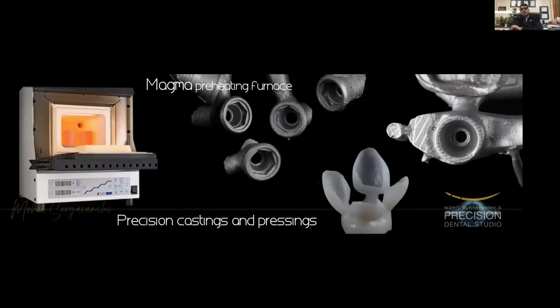Whenever there is a 3D printed restoration, there are casting failures or pressing failures. I get a lot of calls from all across the country. I try to tell them this is the reason, because we are not following the heating stages. So you need to have a programmable furnace which gives you the possibility of heating your investment ring in various stages. You cannot just put the ring into a very hot furnace like you used to do with the wax. When it comes to precision castings and precision pressings coming out from the 3D printed resins, you need to follow all that.